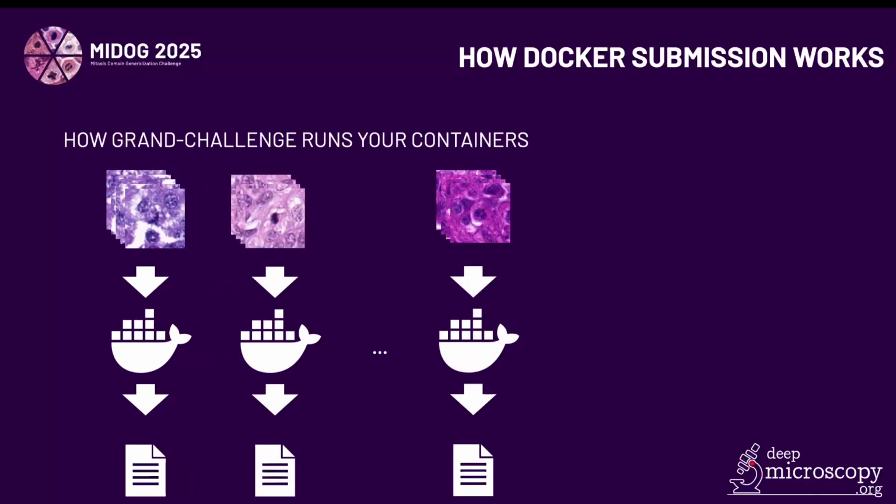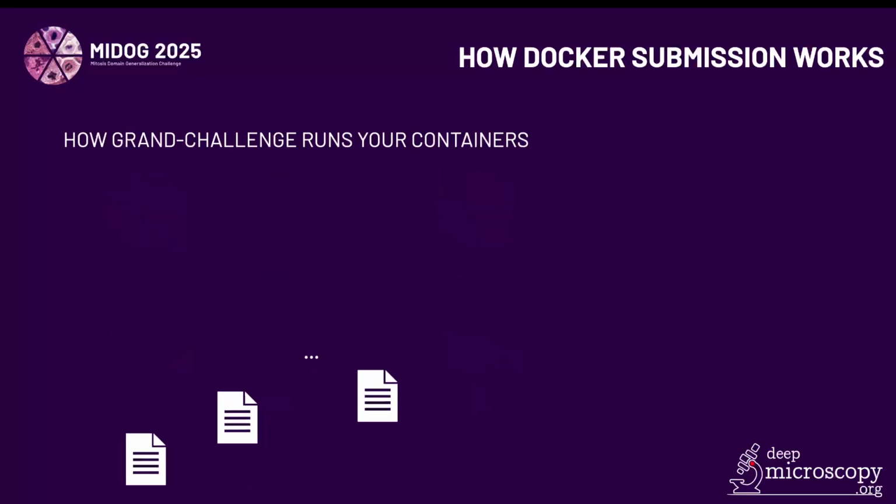We performed stacking of the images since Grand Challenge will run a container independently for each data instance. This includes firing up the container, loading the model, etc. Hence, this is quite inefficient for a simple classification task of small patches like in our challenge. Each container run produces a list of classification results which will then be collected by Grand Challenge.